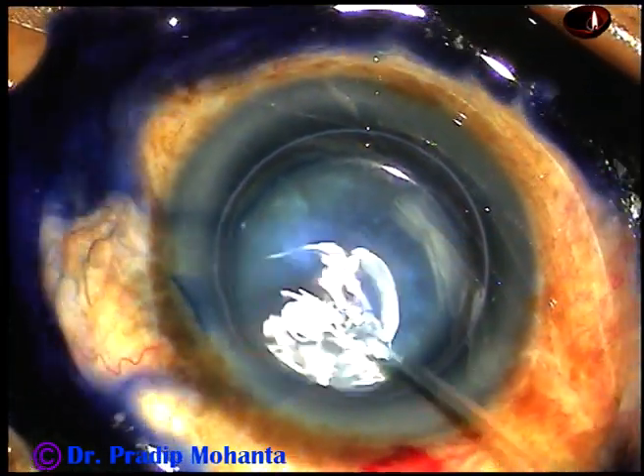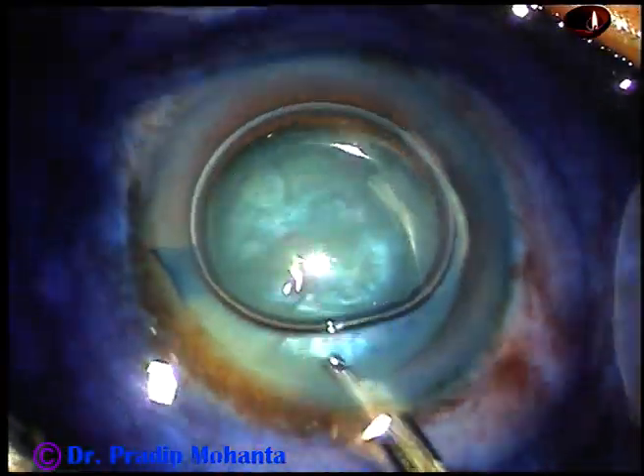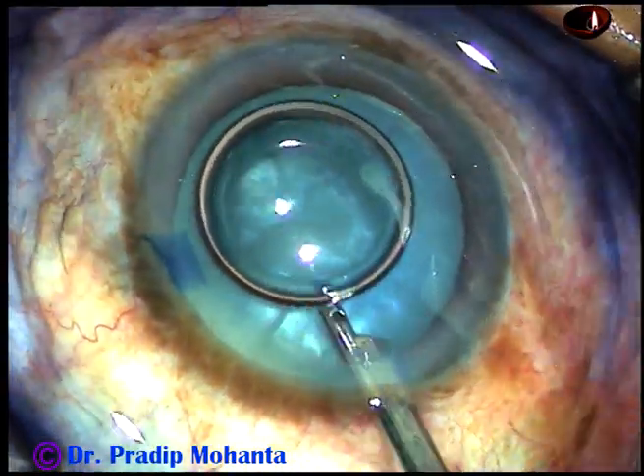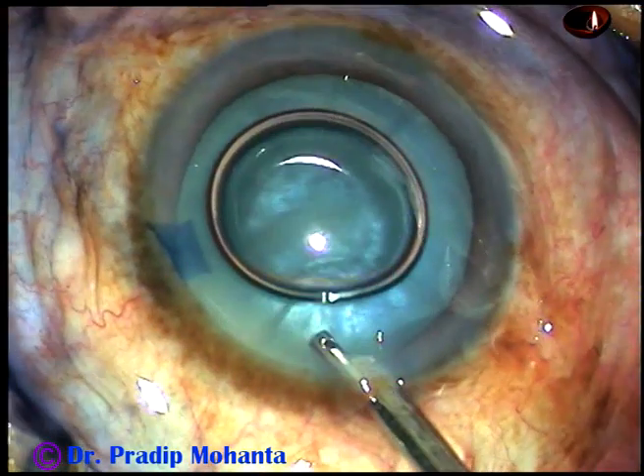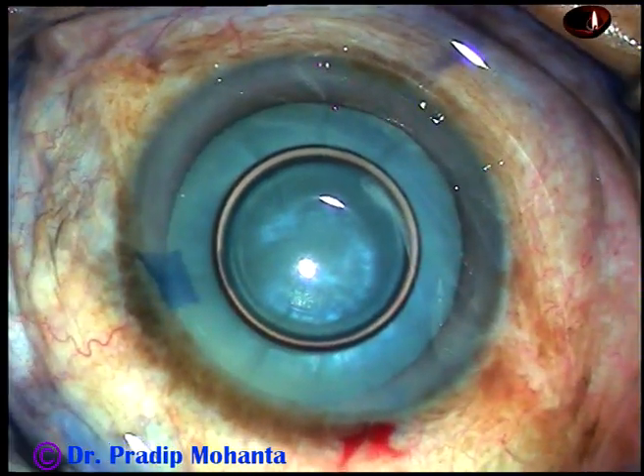This is a totally unedited surgery, and you are going to observe each and every step of the surgery. The dye has been washed out.